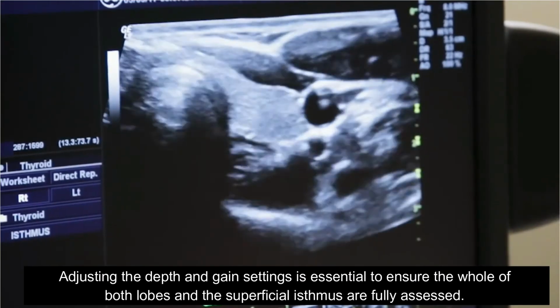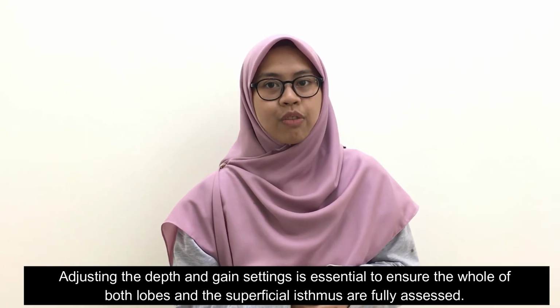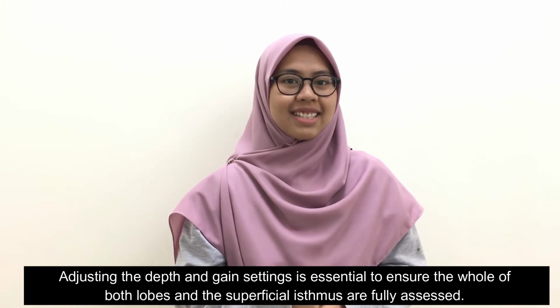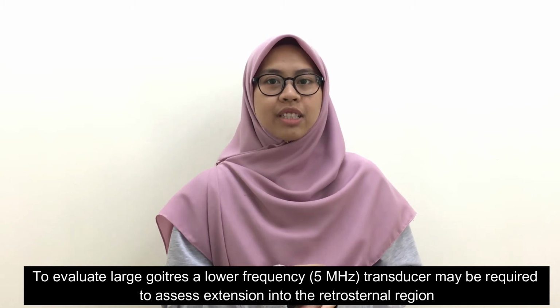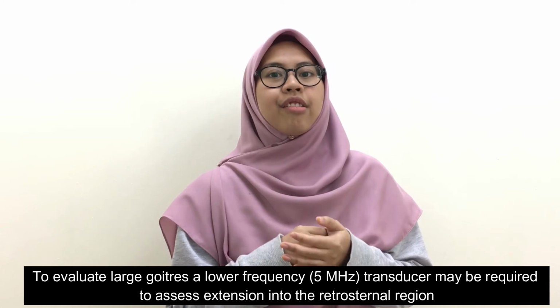Adjusting the depth and gain settings is essential to ensure the whole of both lobes and the superficial isthmus are fully assessed. To evaluate large goiters, a lower frequency, which is a 5 MHz transducer, may be required to assess extension into the retrosternal regions.